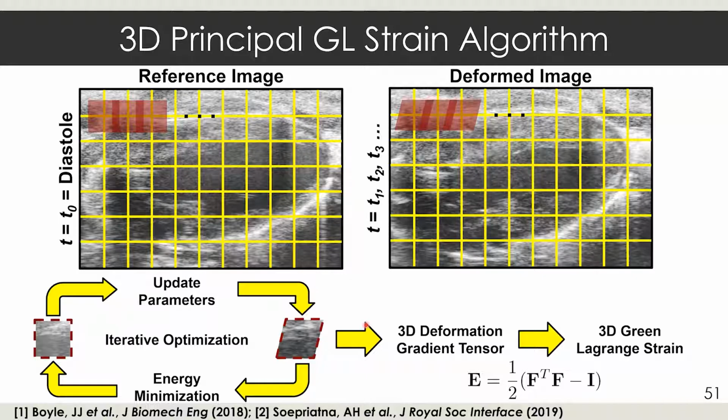We have a question about the isoflurane concentrations and how that might affect heart rate. Can you just comment about any difference in iso concentrations that you used? Right, so there was concern when we first started the study if we use a standard tabletop vaporizer, because heart function really is a function of the anesthesia level of the mouse as well.